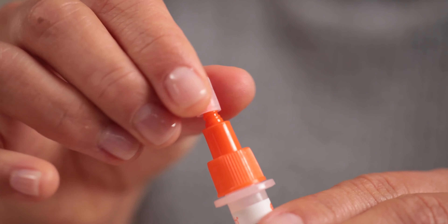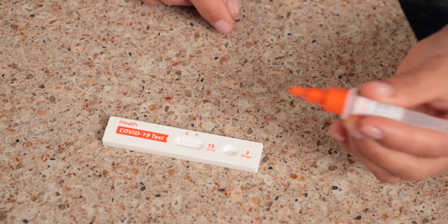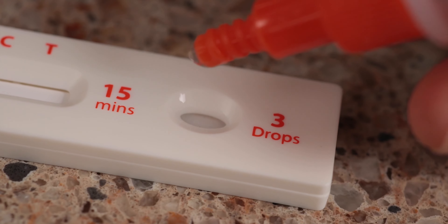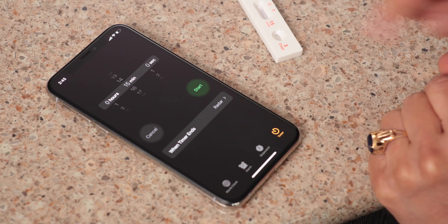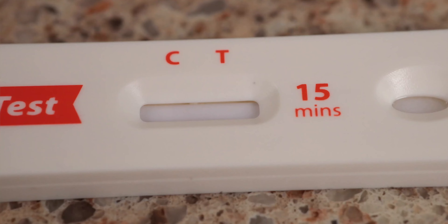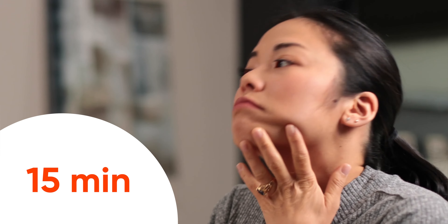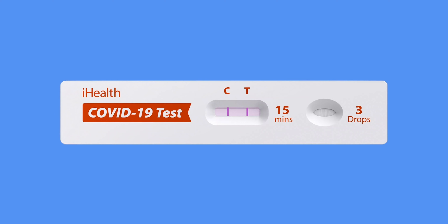You can now say goodbye to that swab — you grew so close in such a short amount of time. Now let's test the sample. Remove the small dropper lid at the tip of your test tube and carefully squeeze three drops of solution into the receiving port on the test card. Set a timer for 15 minutes. You'll see your sample being slowly absorbed into the test strip, and over the next 15 minutes your results will appear on the test strip as lines under the C and potentially the T.